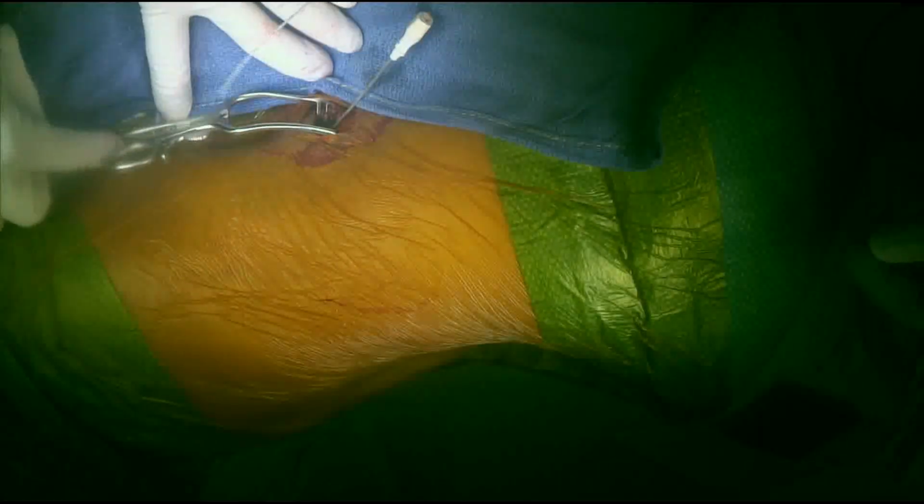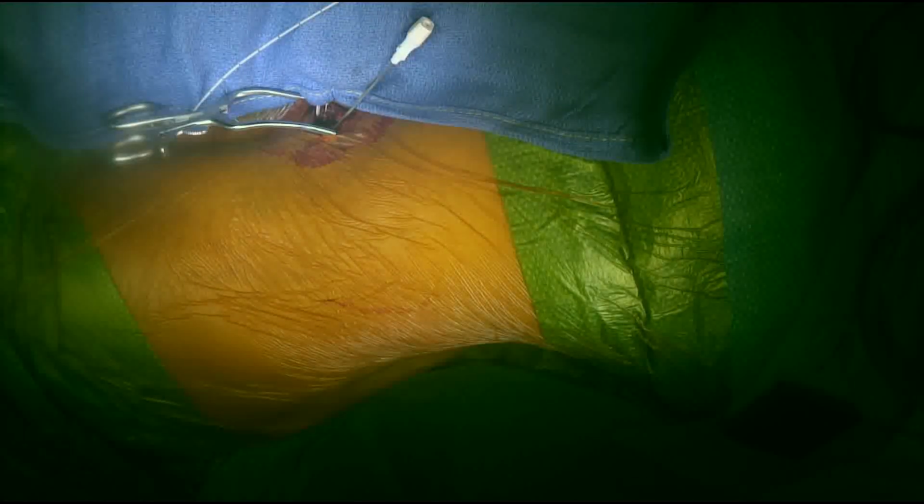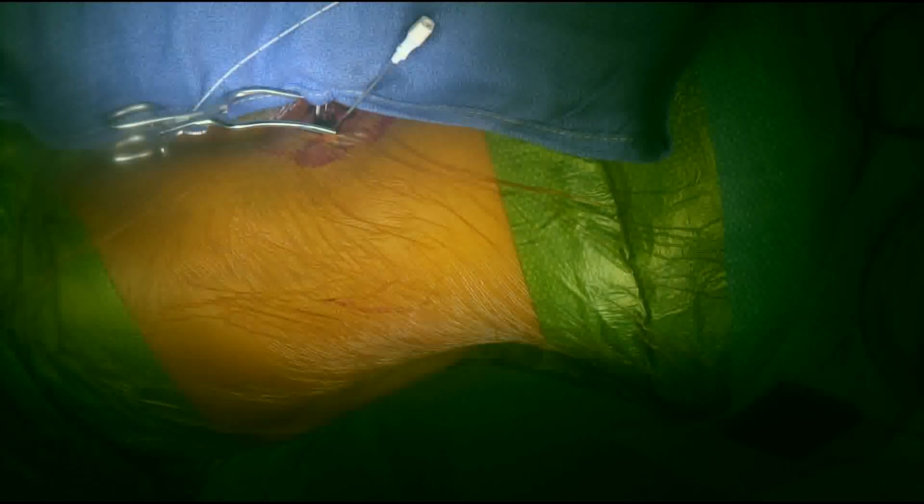For the case presented in this video, we have used the Medtronic SynchroMed 2 device, and we had a company representative with us during the case to make sure that someone who is familiar with all the instruments and equipment is around in case. Depending on which device you decide to use for your patient, there may be some differences in the steps for this surgery.